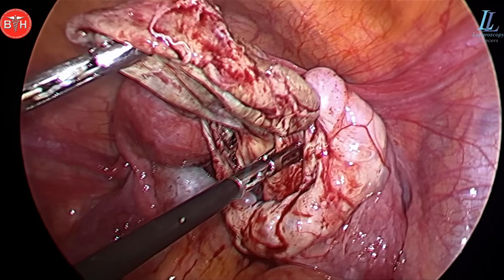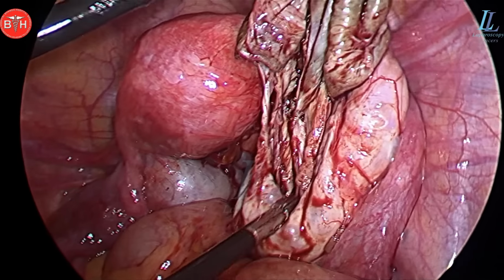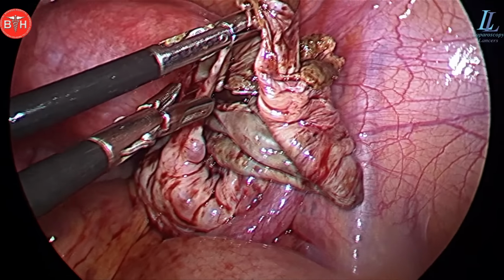Your hand grip should be good enough so that you can pull it out. Here you can see step by step traction and counter traction. That is the key of surgery. Holds true with laparoscopy also.